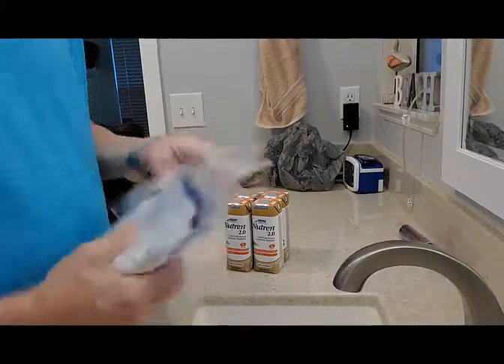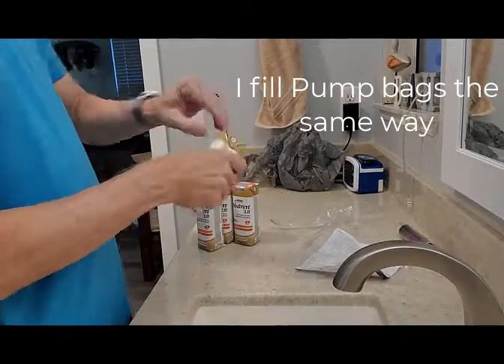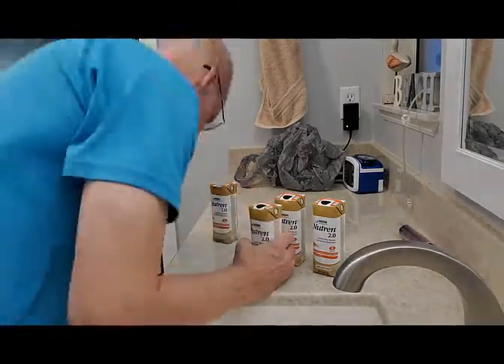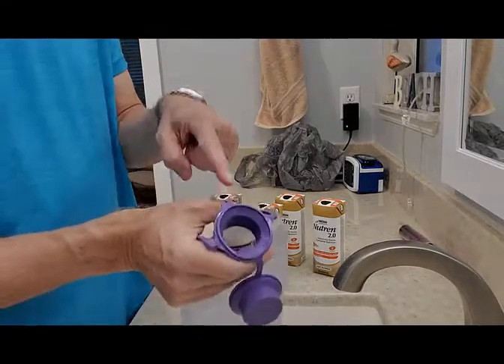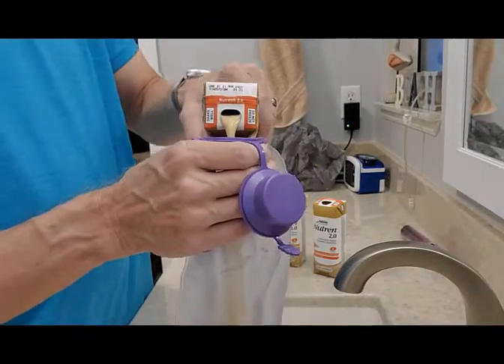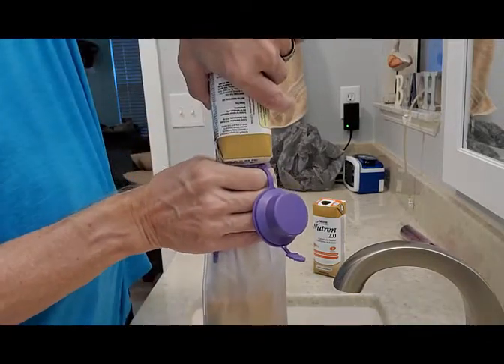First, we're going to look at the gravity bag. Setting it up is pretty simple. You have to pull the bag out and get everything ready. Make sure your clamps are closed, because when you're loading this, you don't want it to just pour out into the sink or on the floor. That gets messy. But you get it ready and then you start pouring in.